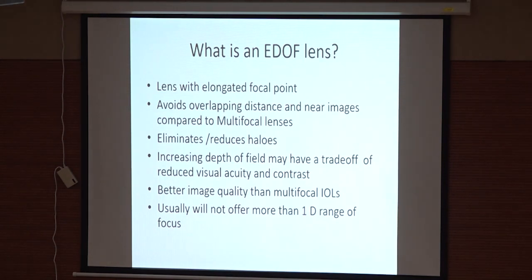But increasing the depth of focus, again, please excuse the field, may have a trade-off in reduced contrast and visual acuity. So to have something available, you will actually sacrifice a little bit of quality on the other side. These lenses have better image quality than multifocal IOLs.